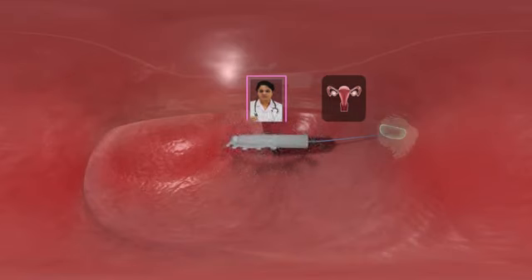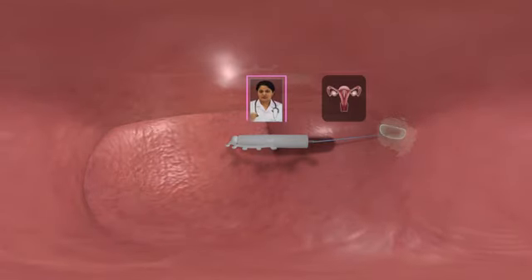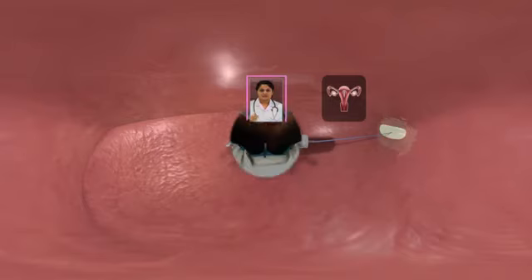The release of levonorgestrel downregulates endometrial estrogen and progesterone receptors, suppressing endometrial growth. After the placement of EMILY, the endometrial mucosa thins. Thereby, the bleeding becomes less in quantity than usual, solving the problem of AUB. By the local action of levonorgestrel, the viscosity of the cervical mucus increases, inhibiting the passage of sperm, hence acting as contraception also.